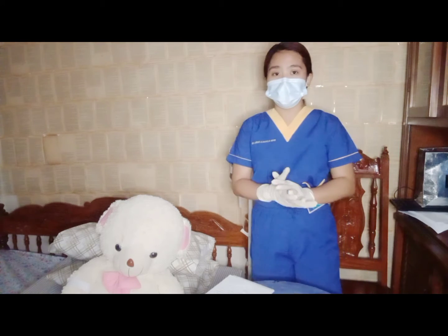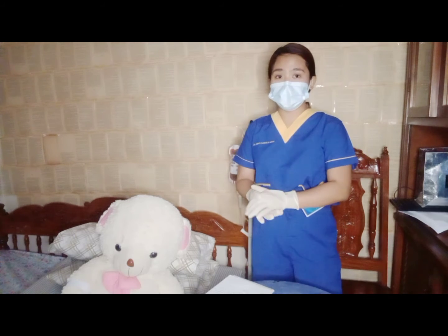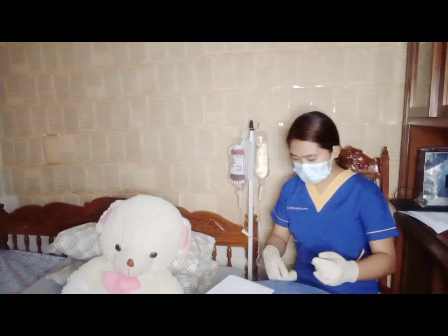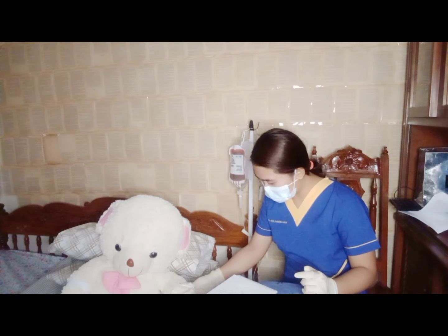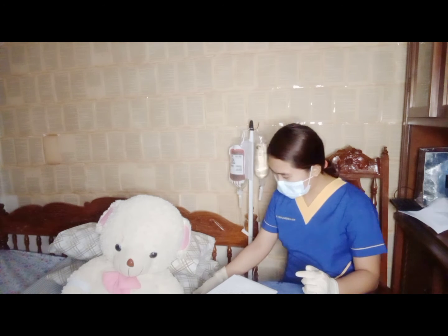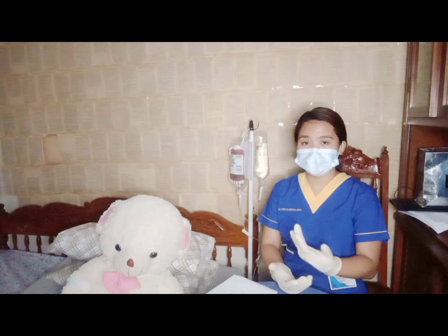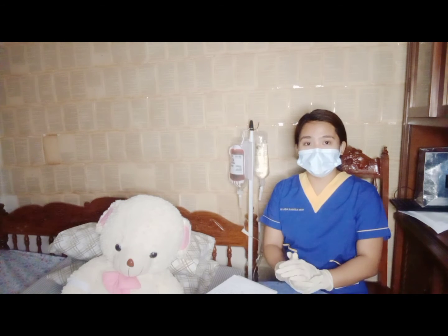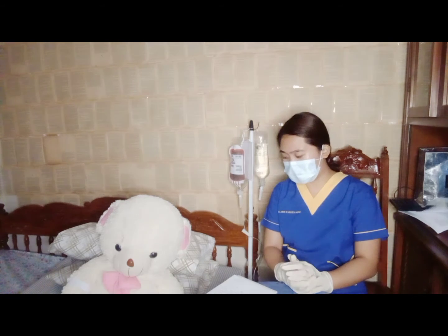So, for the first 15 minutes, we need to observe the patient for any adverse reaction. Okay, then let's check the site for any infiltration. So, ma'am, masakit po ba? May masakit po ba kayong nararamdaman? Okay, wala. So, we need to observe the patient for flushing, dyspnea, itching, rash or hives, and other adverse reactions.